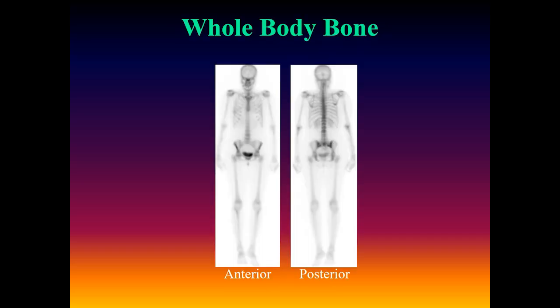This is a state-of-the-art whole-body bone scan on a dual-head gamma camera, single-pass anterior and posterior views. The whole scan takes somewhere between 15 and 20 minutes to acquire.